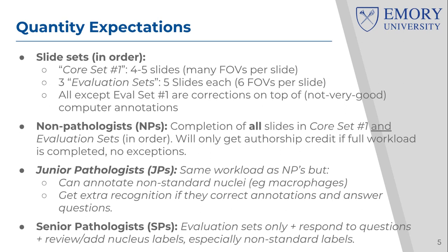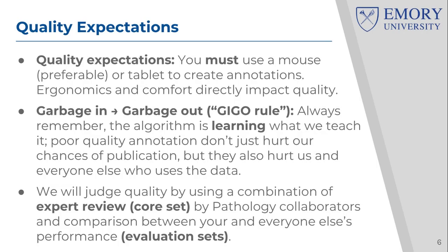Junior pathologists make primary data but may help with the supervision if they want. Non-pathologists are the majority of the people in this study, and the majority of data is going to be created by the non-pathologists. Okay. All right. So that was the quantity expectations.